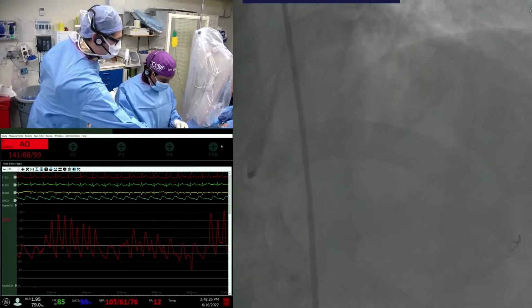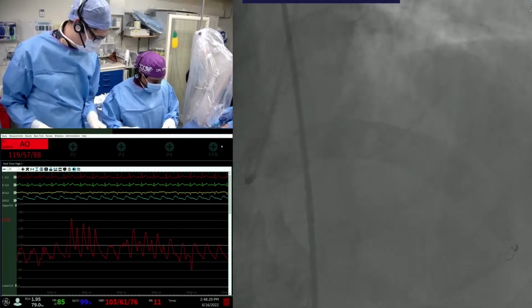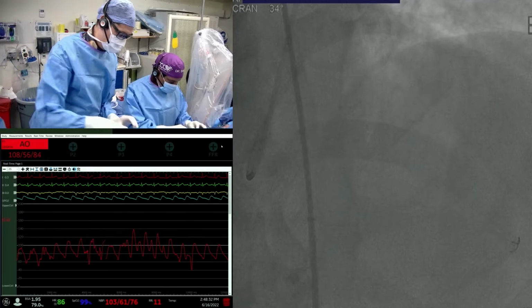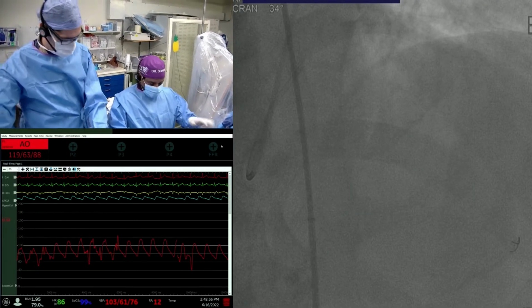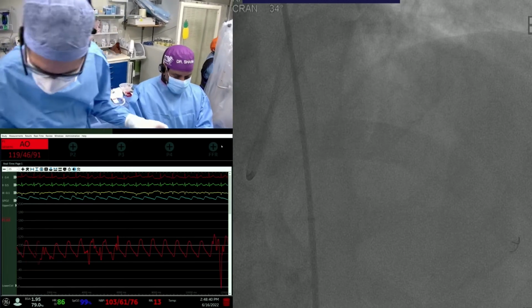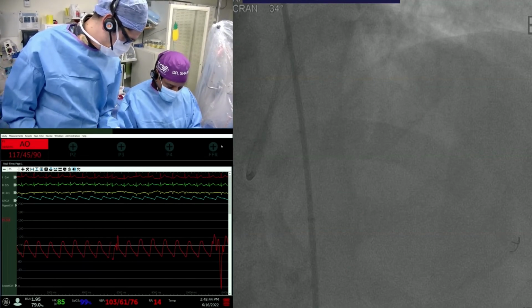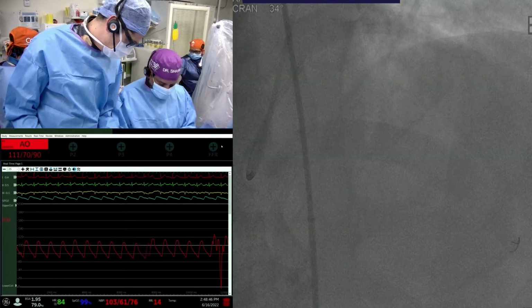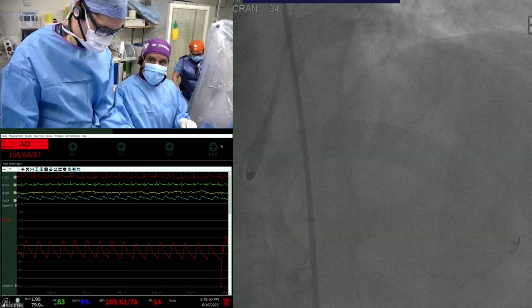I think the concern about this case is that it looks like an aneurysm there, and you want to make sure you go safely there without any perforation, especially with rotational atherectomy, that you have control of that. Again, I prefer to do imaging, if the IVUS or imaging catheter will go, to better understand what this entails.